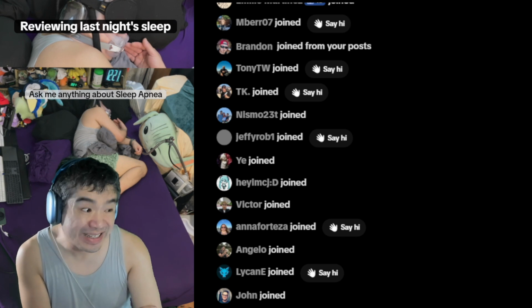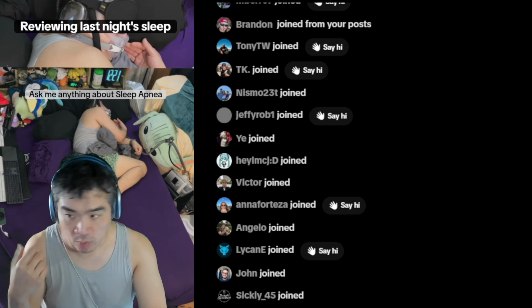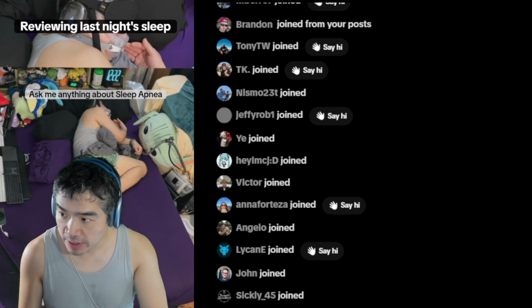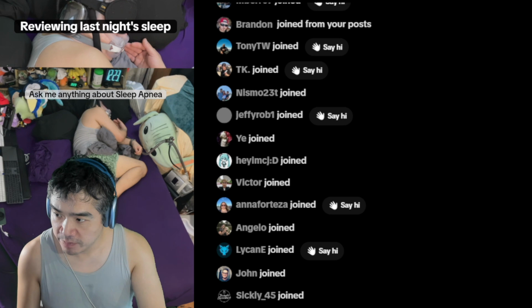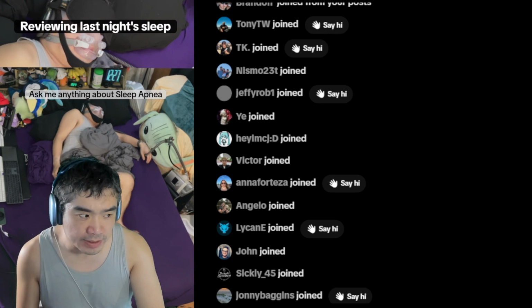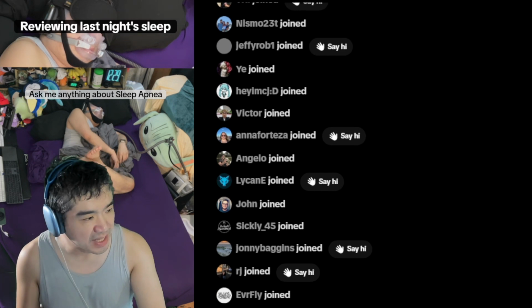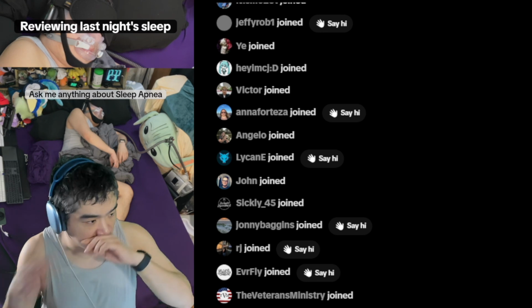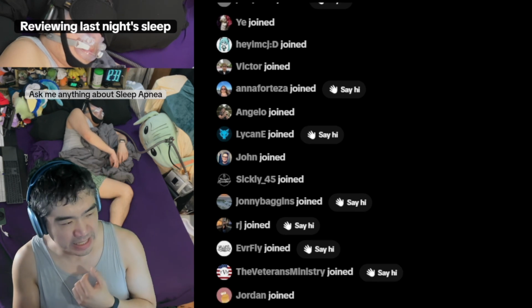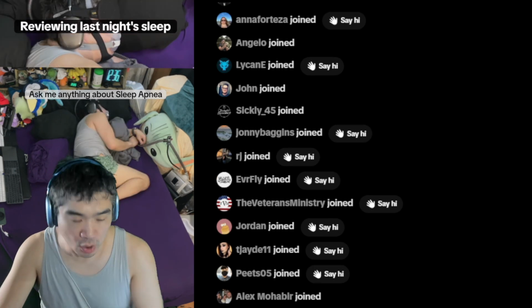There's clear signs that I'm awake. Like I'll lift my eye mask up, and that means I'm awake. I'm checking the time or whatever. But I'm going to be confident to say I'm asleep here. At the beginning of the night, I think it's a little more sensitive to twitchy motions and more likely to record those as being awake. But as it goes later in the night, it takes a lot more motion for the watch to think that I'm awake as opposed to asleep.